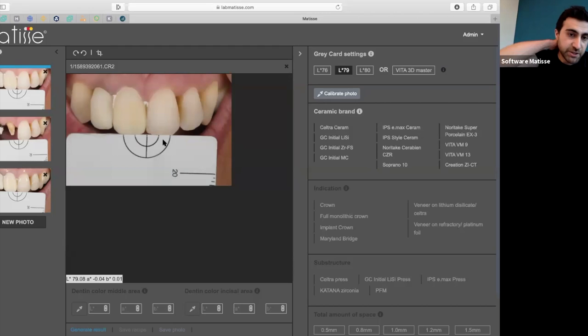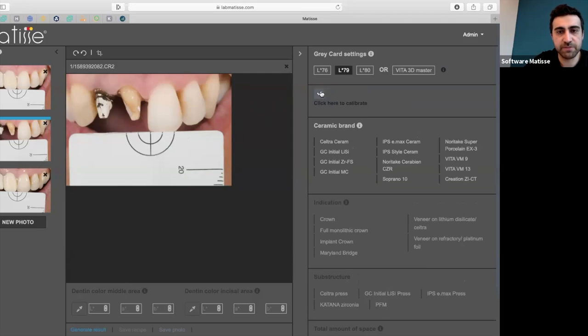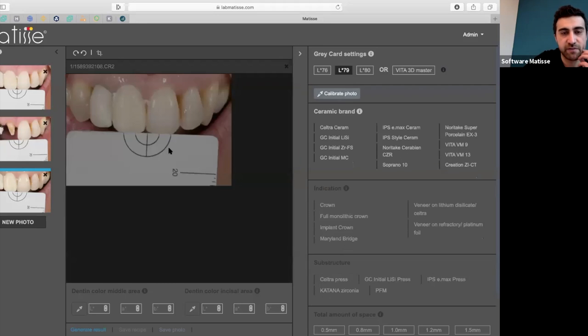So after calibration, when you go with the cursor to the white balance card, you have to see L79. The tolerance that you have is 0.5. Then you also have to calibrate the other two images. So you can see it's very fast and quick.